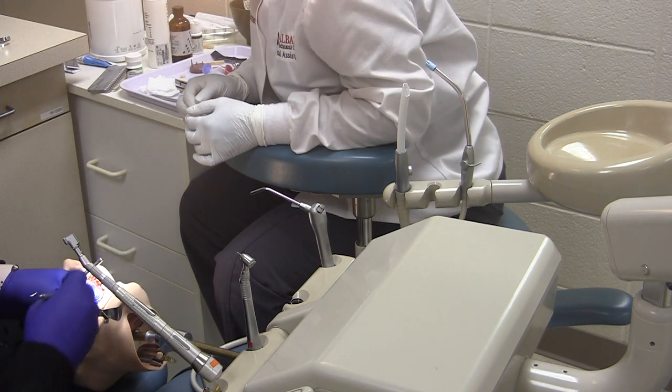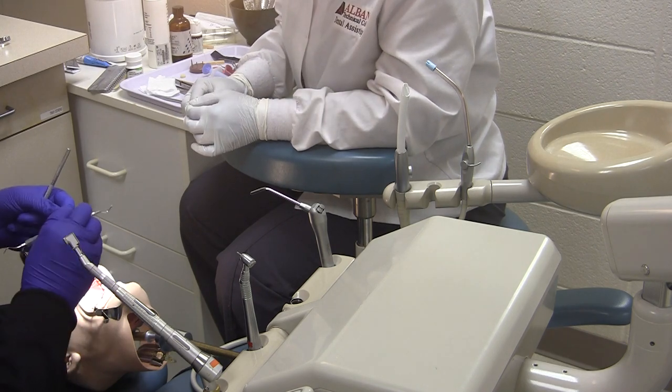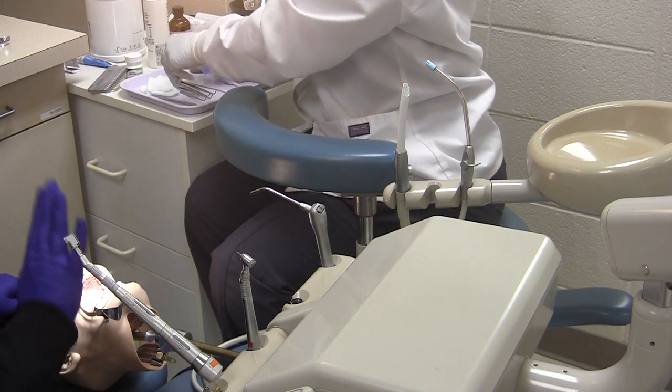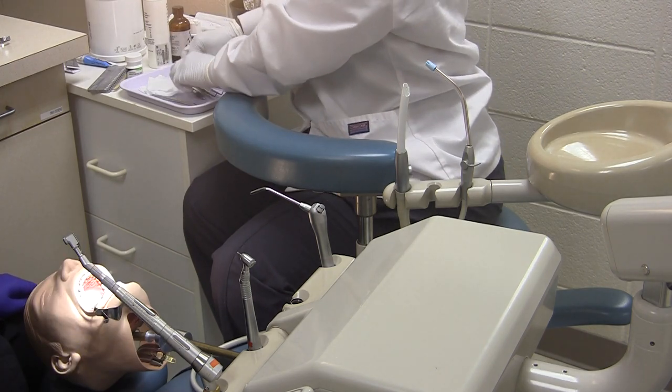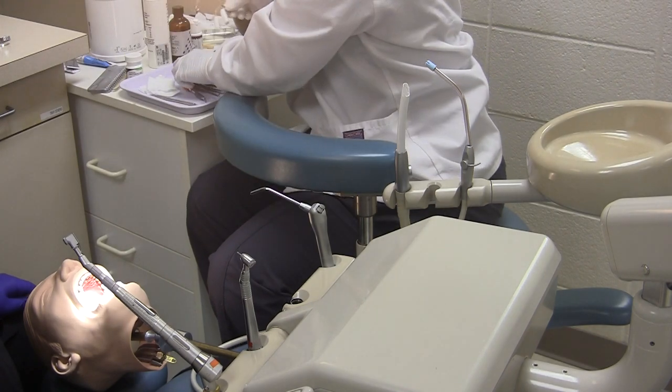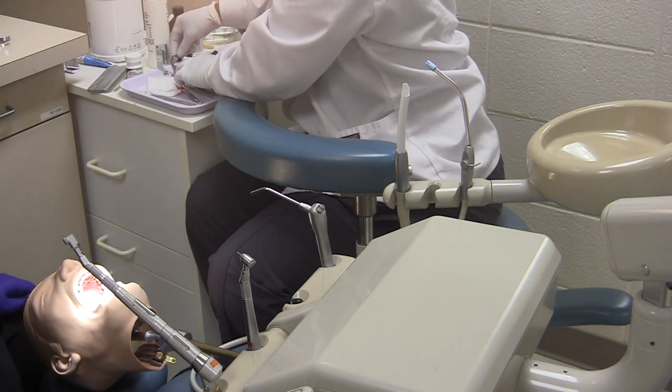After the cord has been packed — in this case we're just going to move it down since we can't really pack it — the assistant will then remove isolation. The dentist will let the assistant know that they can go make their temporary.